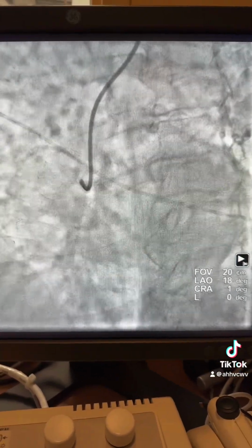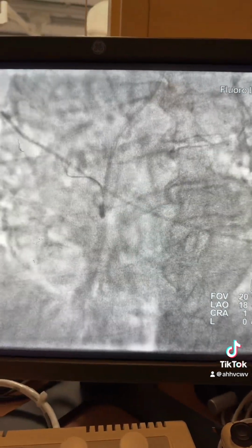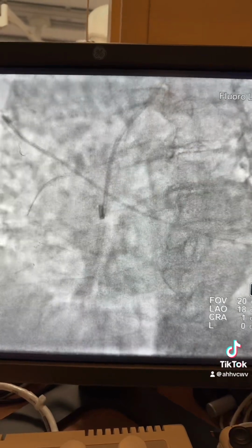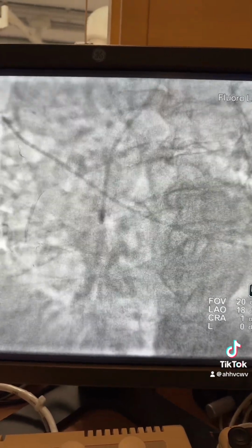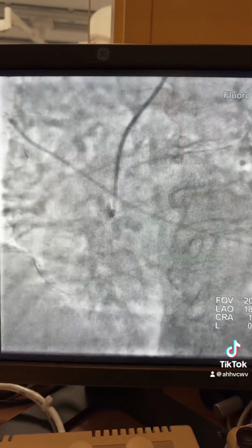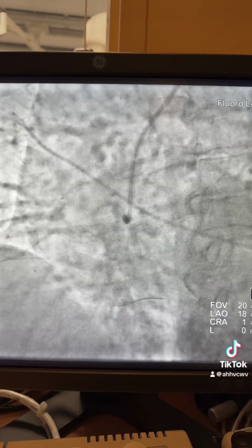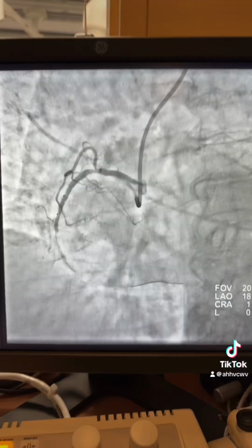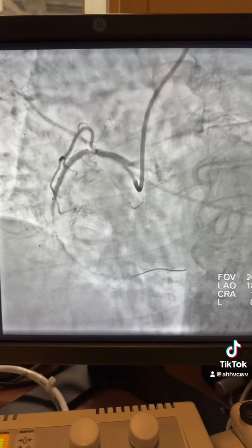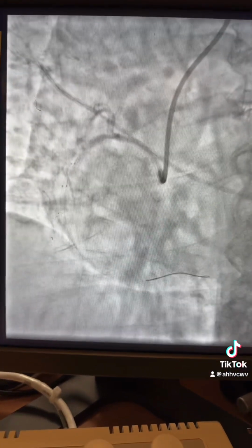Since the catheter did not reach the ostium, advance the Runthrough directed toward the vessel, and then once the Runthrough is advanced distally, you can use the GuideLiner. Of course, first advance the balloon and then follow with the GuideLiner. Once you have the GuideLiner in, you can take a picture and now selectively engage the RCA. You see the tight lesion in the mid RCA.